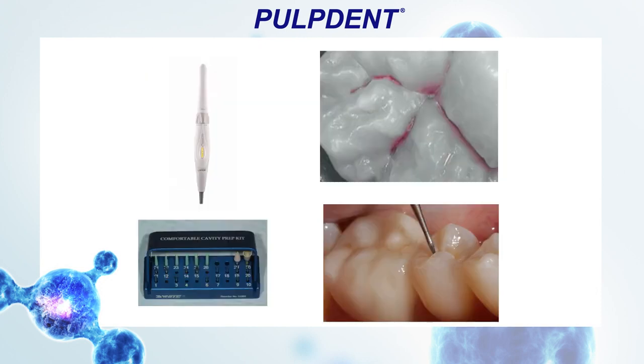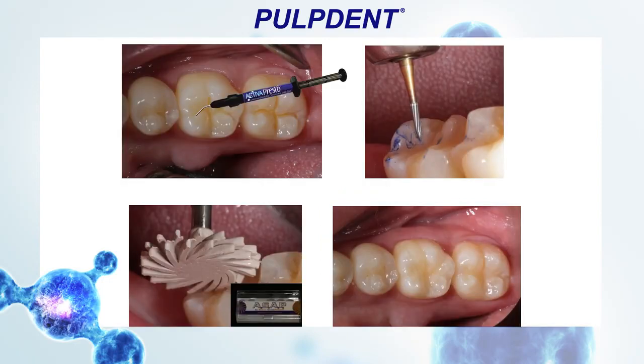So some of my cases from my office, again, using quantitative laser fluorescence and fissurotomy for early diagnosis. You can see these are definitely not GV Black extension for prevention, but prevention of extension, just removing the decay, and then using ACTIVA Presto as the restorative material into those small preparation fissures.